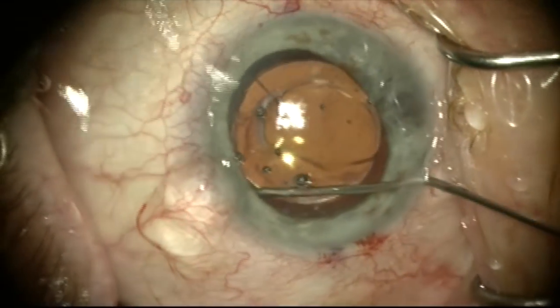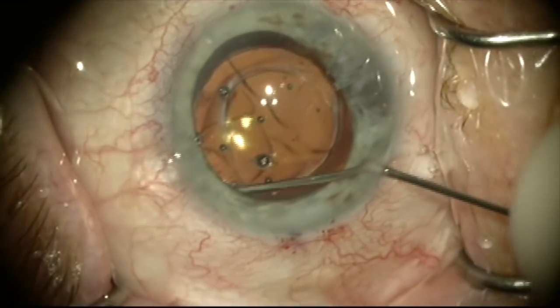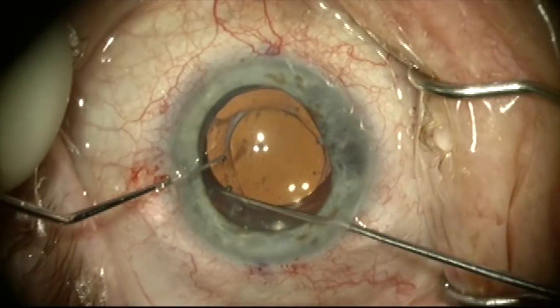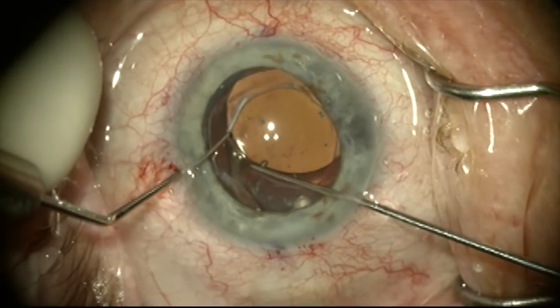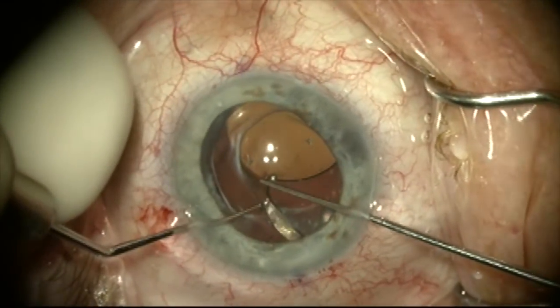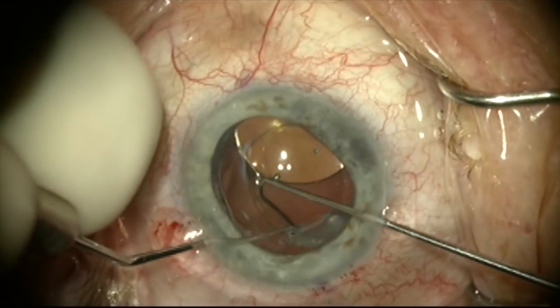Once this is done, the lens is freed up enough and there's enough room to start mobilizing it. I'm now going to use a bimanual technique with two small micro hooks placed through the paracentesis to gently lift up the lens and sweep the fibrosis off of this haptic.